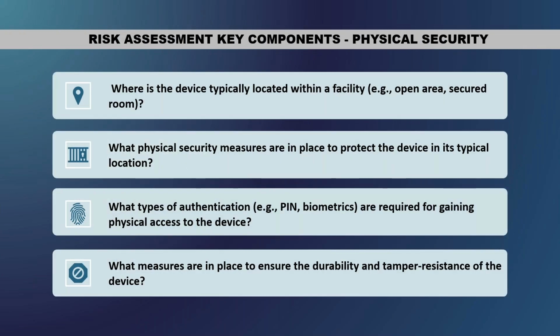Okay, so physical access. I know Jane talked about that a little bit. You also have to understand the physical access of the equipment itself. A lot of times, and I didn't put this on this slide, you have to think about what the system is, like if it's mobile, such as an ultrasound, the USBs. Something that we never ask, and something I always ask when we're evaluating medical devices, is: does it have USBs, and can we turn off the USB? What's the purpose of it?